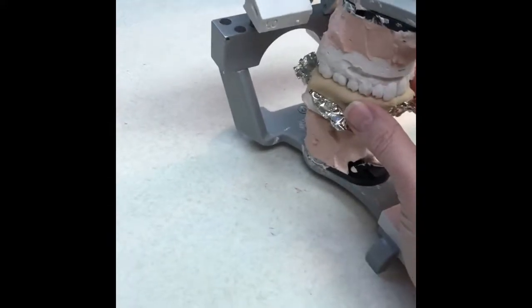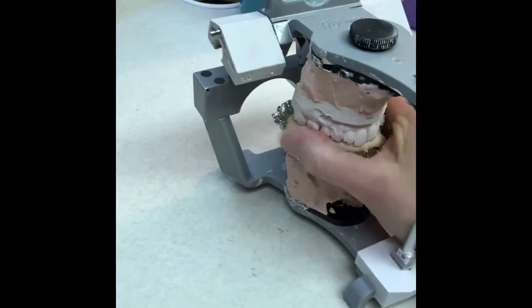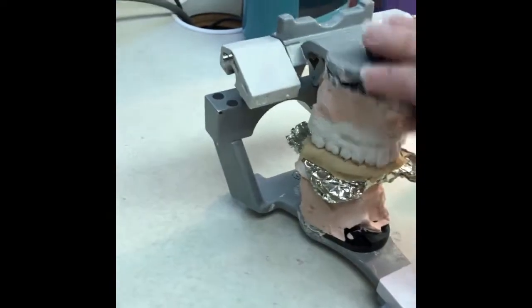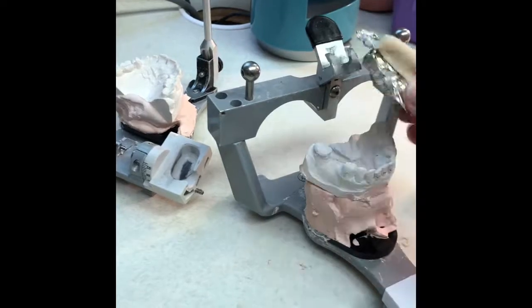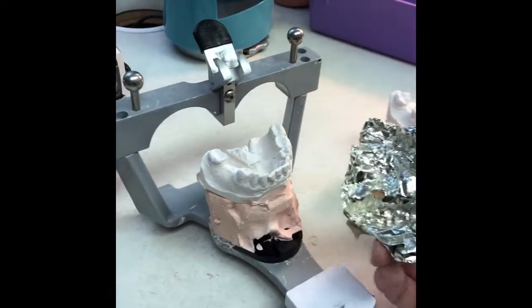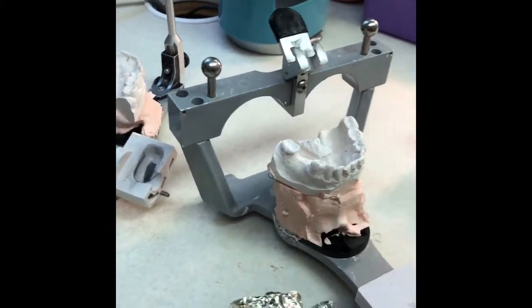Okay, so when the splint was really warm, it got quite a bit cooler. It gets really, really warm to the touch, almost hot. And so now we're going to take this top articulator off. It's already cooled off. Then we take this off. Sometimes it gets stuck. You want to make sure you're not pulling any teeth off when you go to remove the splint. And we can peel off this foil here. Peel off the foil, we get rid of the foil.